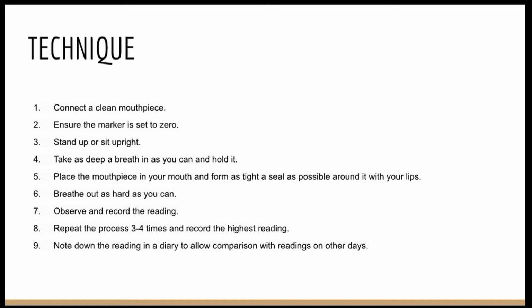Place the mouthpiece in the mouth of the patient and seal the mouthpiece with the patient's lips. Then ask the patient to breathe out as hard and as fast as he can, and observe and record the reading. Repeat the process 3 to 4 times and record the highest reading.